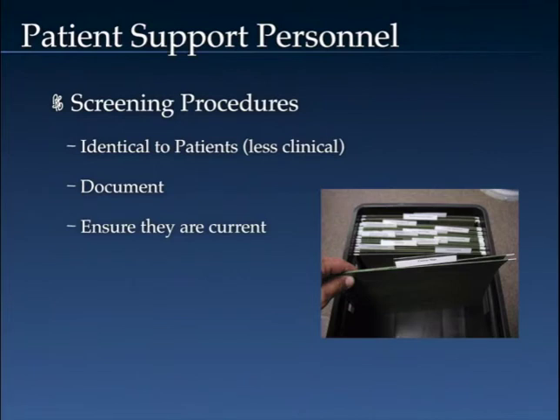There are times in the past I've spoken with technologists, and I've been involved in safety audits at sites, and find that in some cases, ancillary personnel or personnel who are coming in to help with a patient, even though they're going to be there for just a short time, and maybe that's the logic, the site doesn't feel as if they need to document the screening, and this needs to be documented.